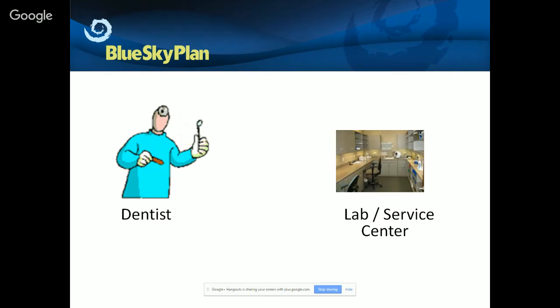The main difference in the process is primarily going to be that the dentist might be handling more of a particular type of implants or particular type of surgical guide, and the lab or the service center might be providing more of an array of services, maybe handling a wider variety of cases. But the general process flows are very similar in both situations.